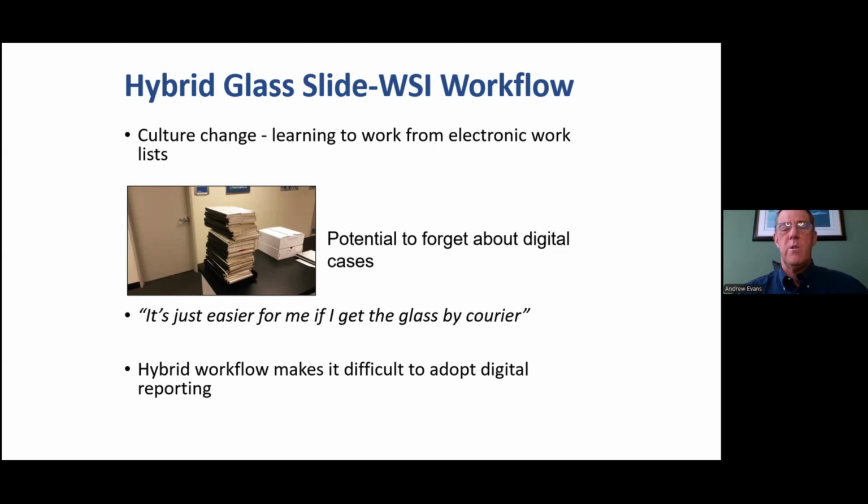There's a significant culture change that's involved here, and you need to learn to work from electronic work lists as opposed to reacting to physical slides that arrive in piles in cardboard trays.